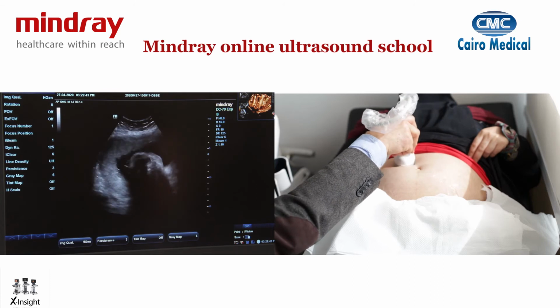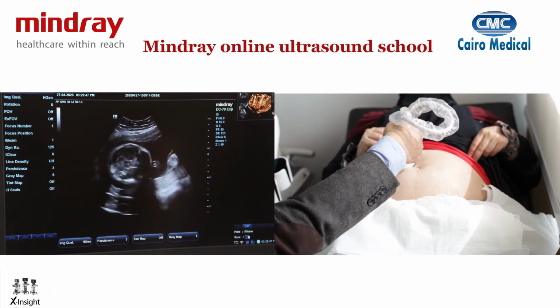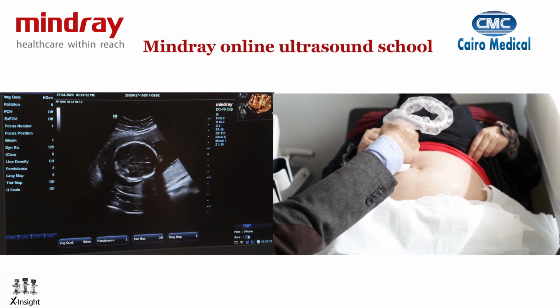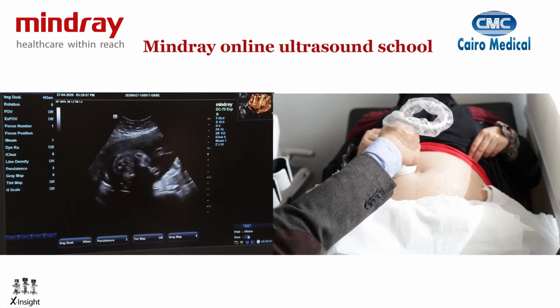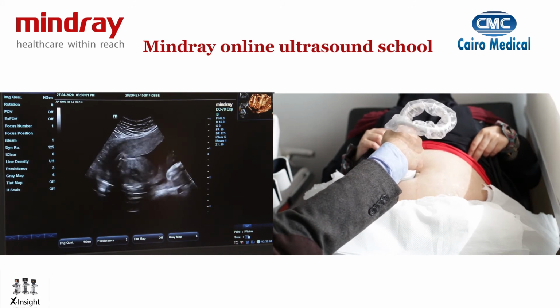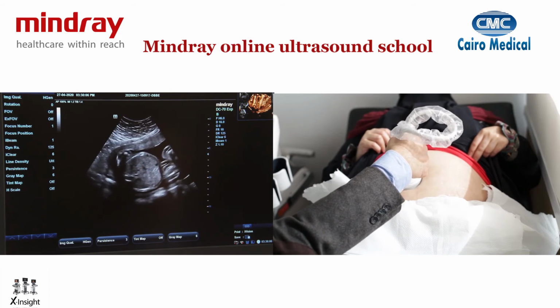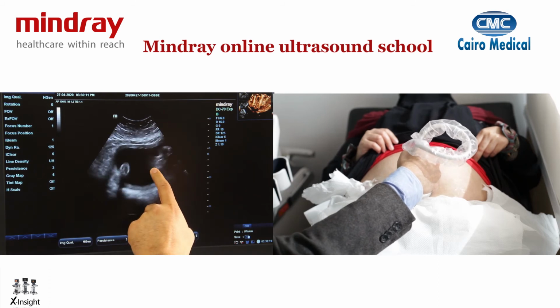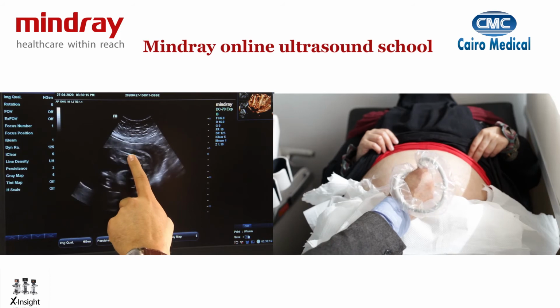So put your probe longitudinal again, see where the midline echo is, rotate 90 degrees, you'll be getting a biparietal diameter and head circumference. If you tilt the probe gently at the back part, you'll be seeing the cerebellum, as you can see here. If you sweep across the baby's body, still with the probe touching the abdomen at a 90 degrees angle, you'll see the 4 chambers of the heart. If you keep sweeping downwards, you'll see the stomach. Below it, you'll see the cord insertion. If you keep sweeping down, you'll see the iliac bone. Once you see the iliac bone, rotate your probe 90 degrees, and you will get the femur.